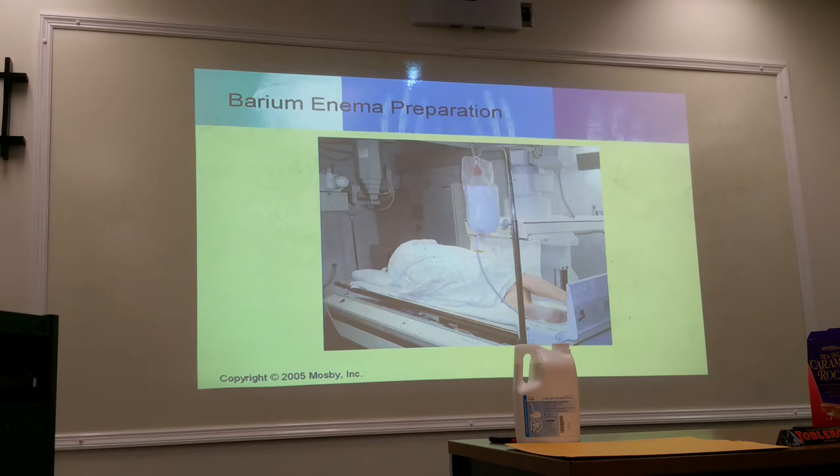And the doctor will say, barium on. Remove the clamp. Barium off. Clamp it. Barium on. Remove it. Give them five puffs. Okay, stop. Okay, barium on. Give them 10 more puffs. So that's what you'll be doing: puffing and clamping, and making sure that they don't get tangled in this mechanism.